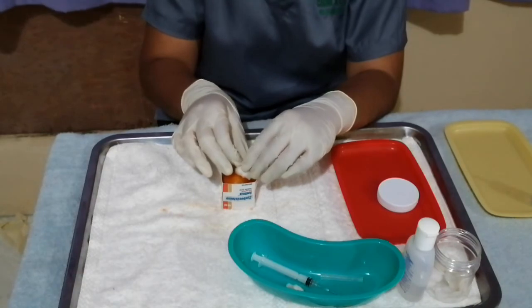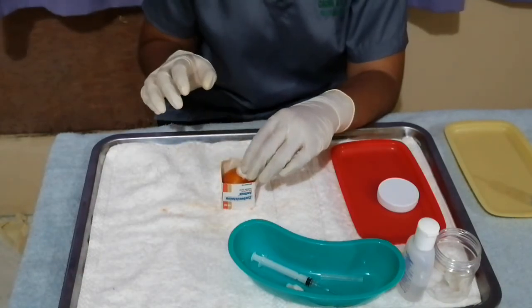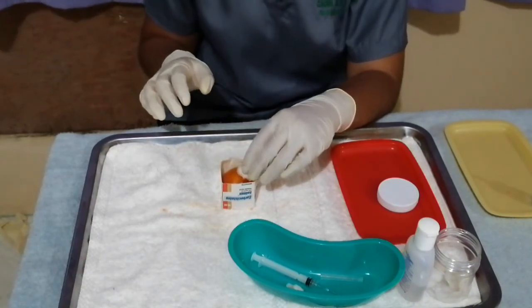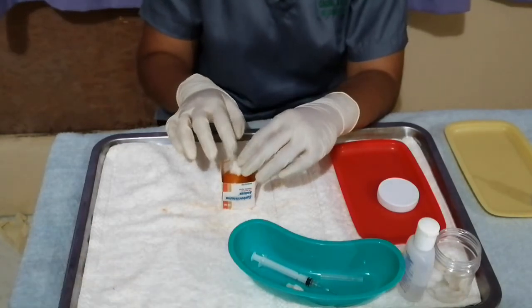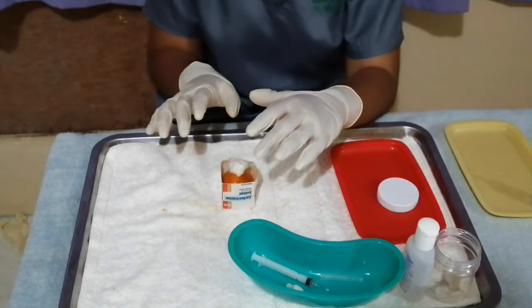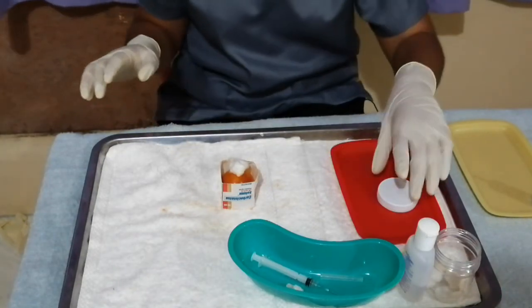Next, we're going to keep the injection site clean and covered. Do not rub the injection site. So we're not going to rub it, and assuming that it's already plastered, we're going to make the patient comfortable.